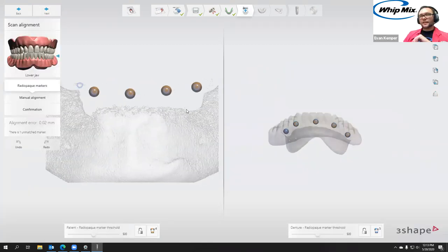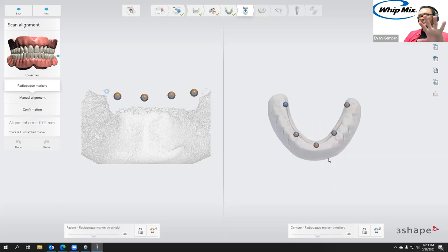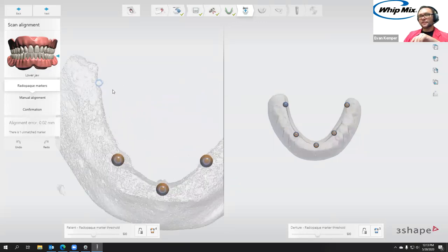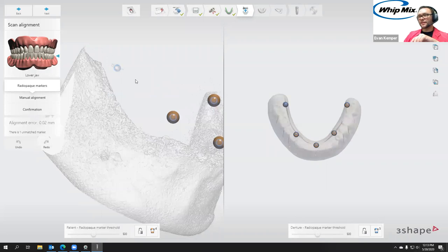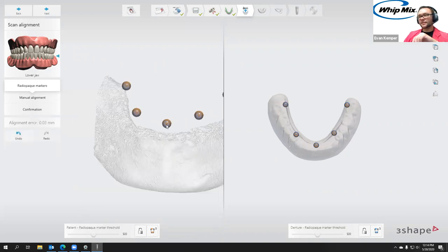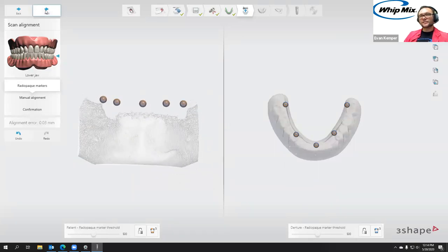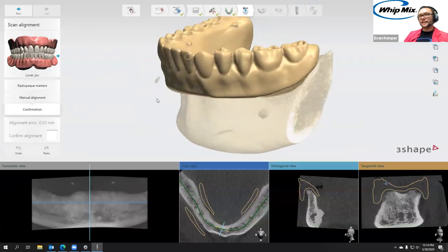Now we're in the scan alignment. You can see that out of the five markers, it's identified four of them automatically and just needs confirmation on this one. There's enough scatter in the image — it wasn't quite sure of the match. It's already identified it on the denture, so we just need to click here. Now we can see the orange spheres with the blue ring and the blue with orange — everything is auto-detected and correctly identified. Then we click next, and you can see that's lined everything up for us.